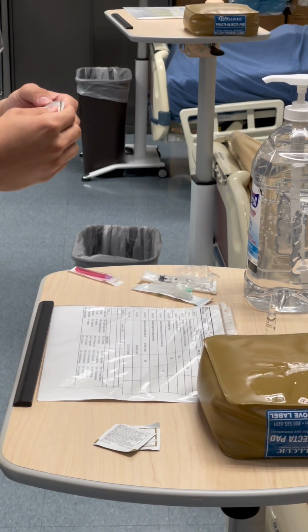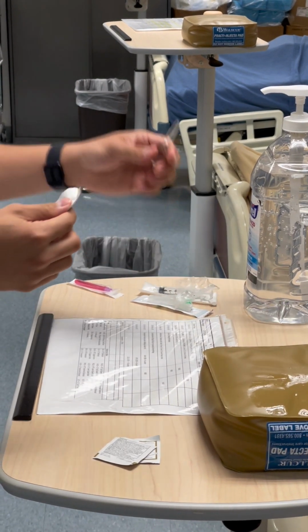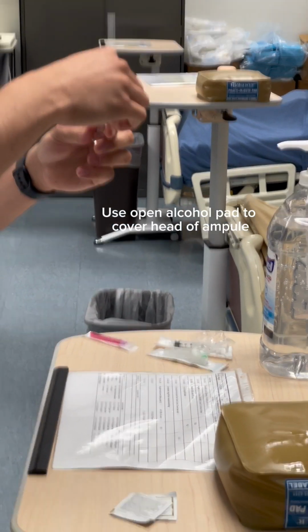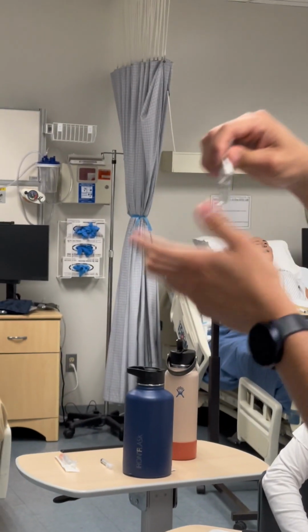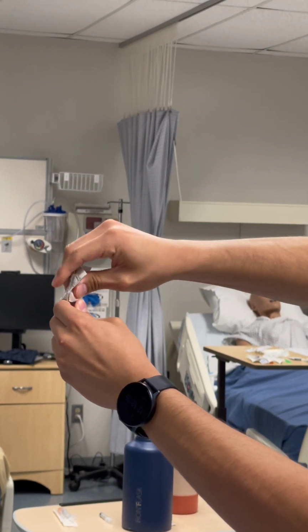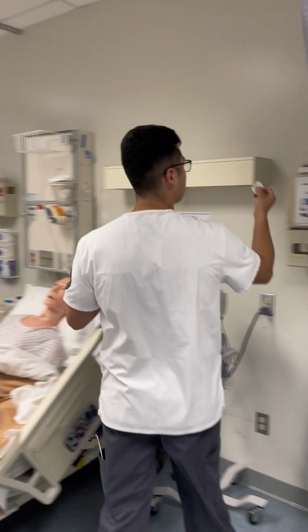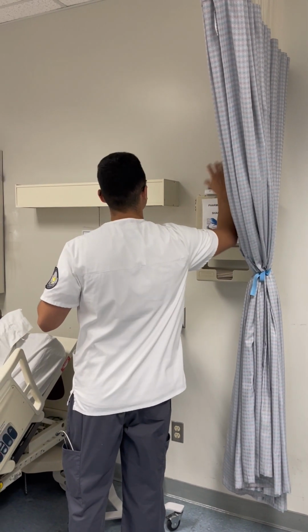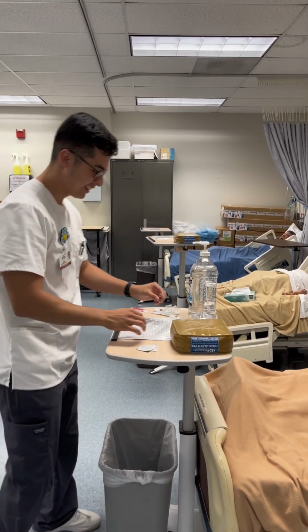Okay. So the ampule is swirled. I'm going to then point this away from the patient and away from me. I'm going to break it away from me. Okay. Immediately I'm going to dispose of this into the pharmaceutical waste.